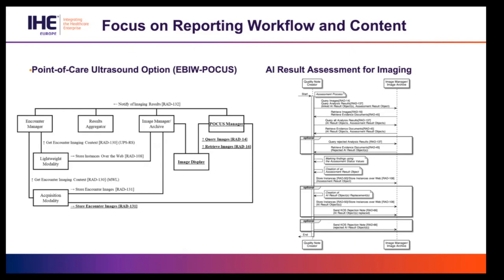So with this additional option, the EBIW profile is extended by inclusion of POCUS manager and image display actors, and defining the transactions and specific requirements for the transactions, like query images, retrieve images, which are still quite common in the radiology space, but putting additional requirements on those for these specific purposes. Next slide.